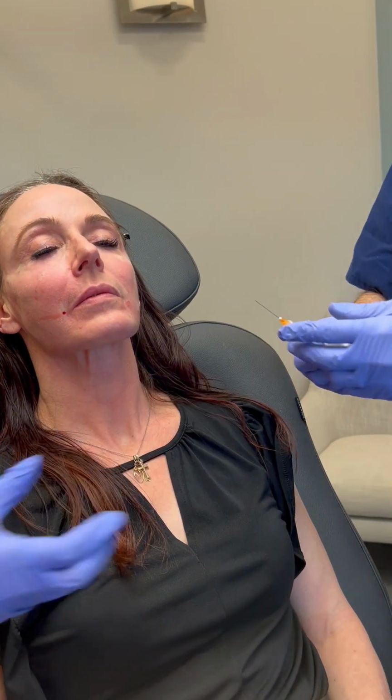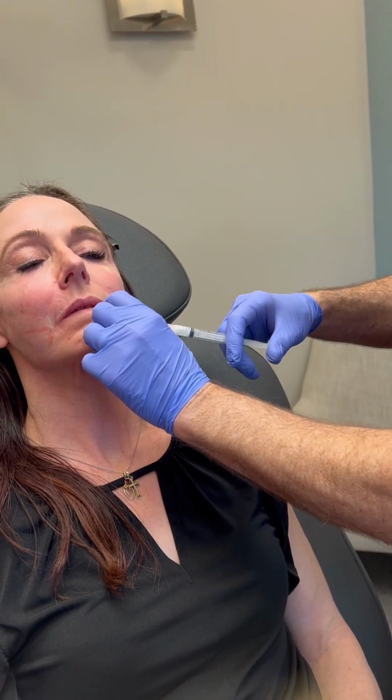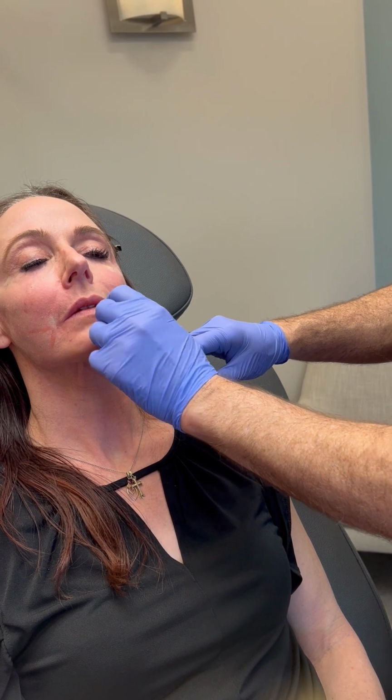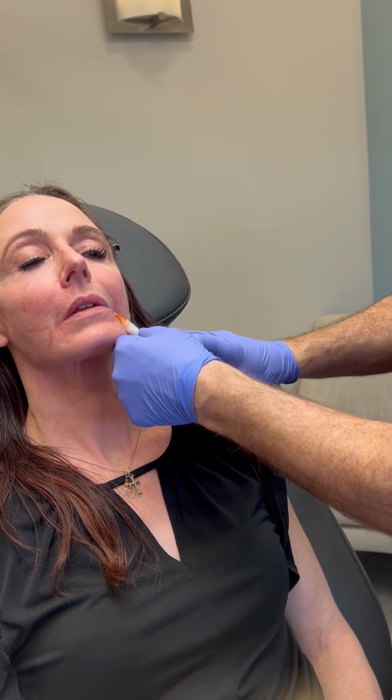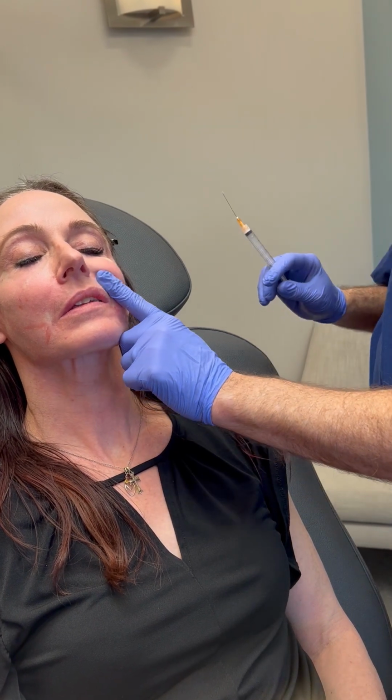Just going to massage that, and then we'll go around and do the last one here, and that's the Sculptra. That was 2 vials of Sculptra. And again, we will aspirate, and then like that. Good.